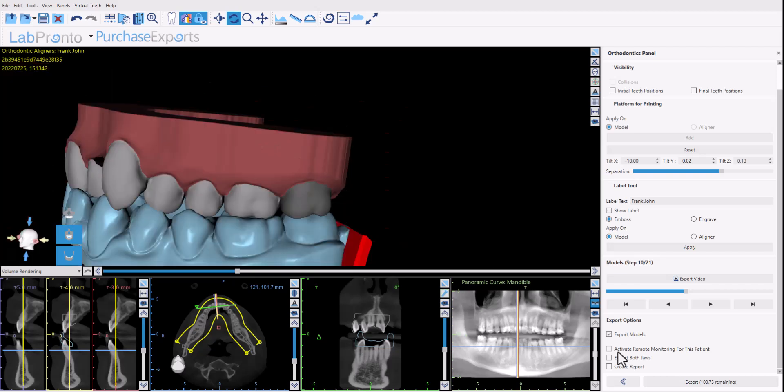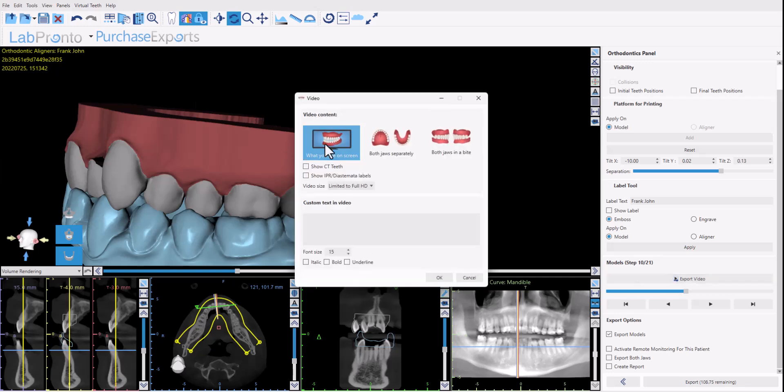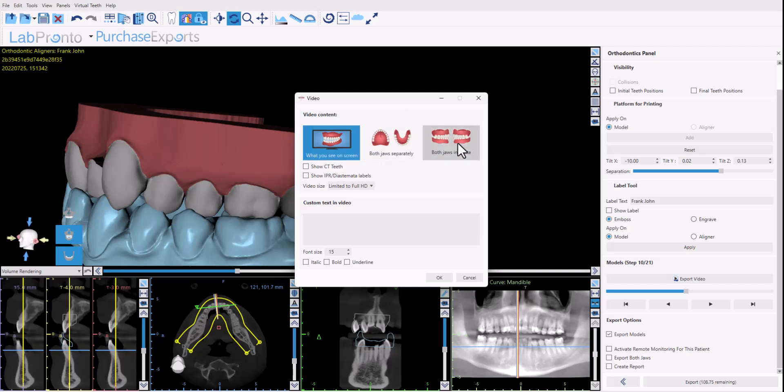Continuing in the panel we have the option to export the video. We had this at an earlier step as well. After the teeth movement steps you're able to export the video as well. We have the functionality at the export stage in case you want to export the video at this point as well. So if you click export video you have different options on the screen. What you want to include in the video, either the view on the screen currently or to show both jaws separately or both jaws in a bite. So select the relevant option.